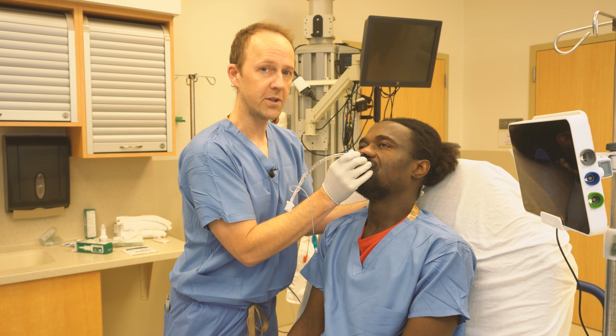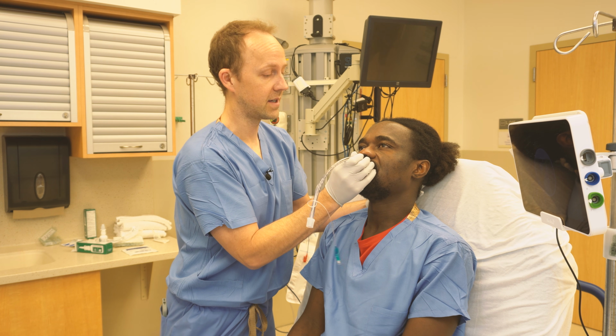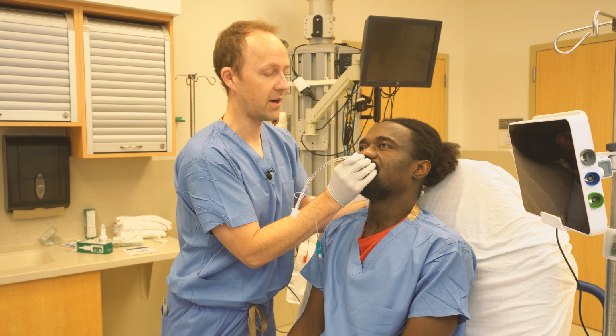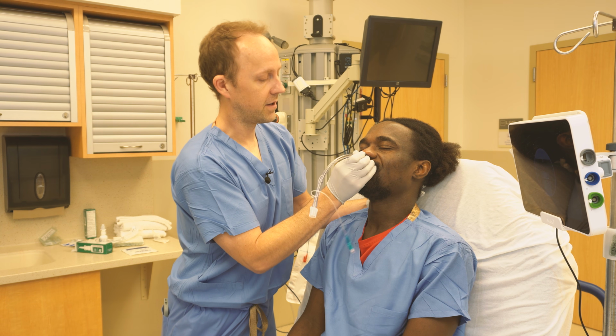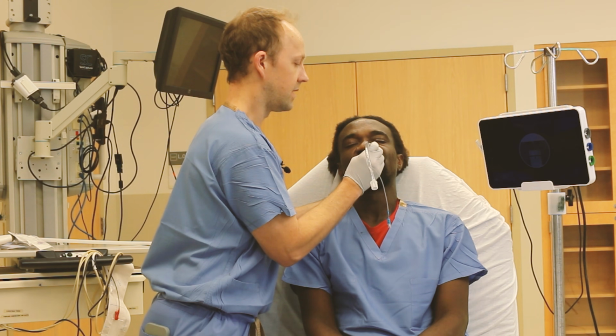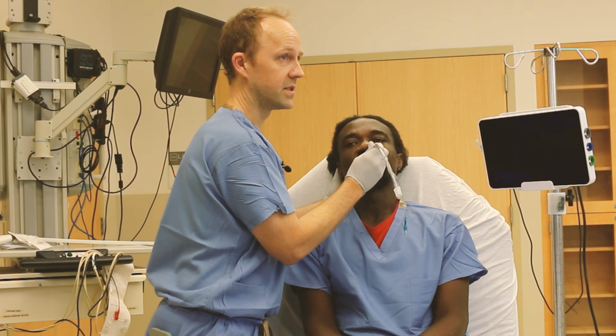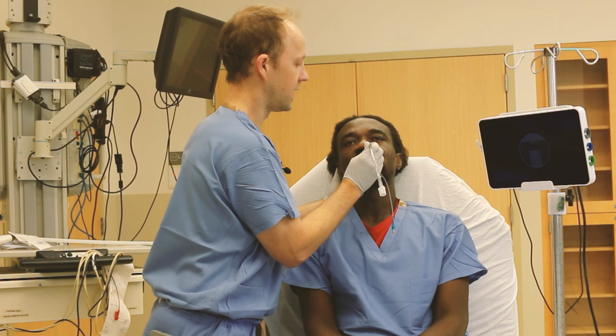And every now and then, we try to do this without sedation. The reason we're doing it without sedation is because if you're doing an awake intubation, it's because it's on someone with a really tough airway. And if they have a tough airway, you want them to be in control of their airway and able to follow commands. So if they're dissociated or too sedated, they're not going to be able to follow commands.